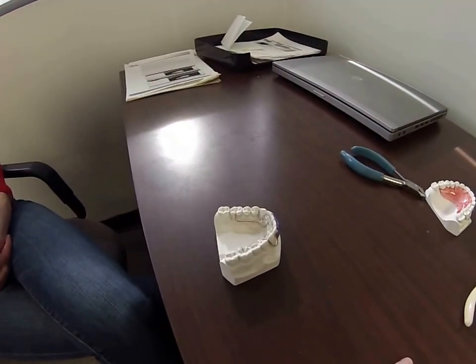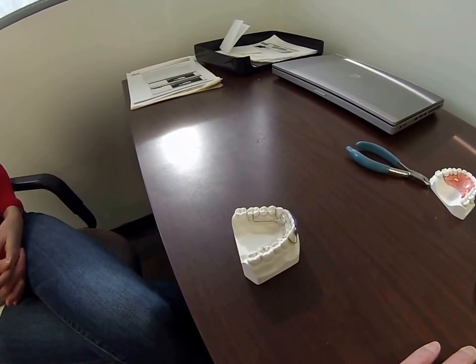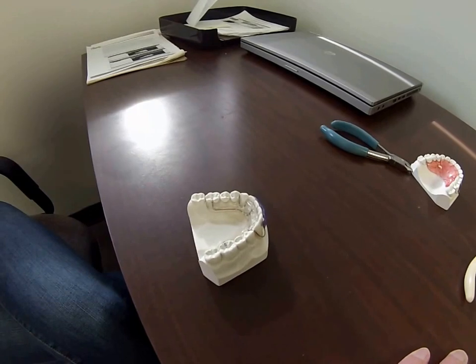Good morning everyone, this is Phil and Megan from Perfect Finish Ortho Lab. We're here this morning to demonstrate how to adjust a modified spring aligner. There are basically two adjustments that you will need to do on follow-up visits.